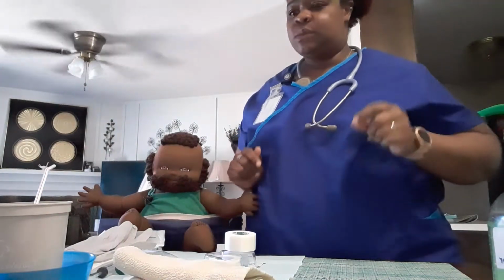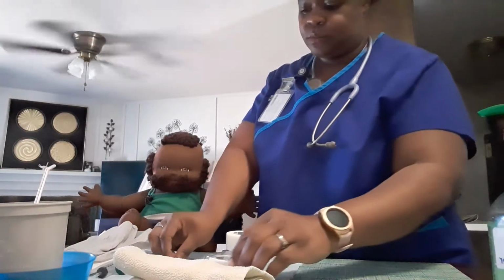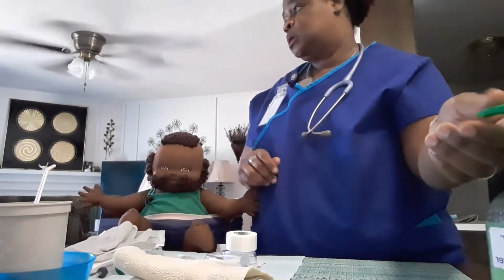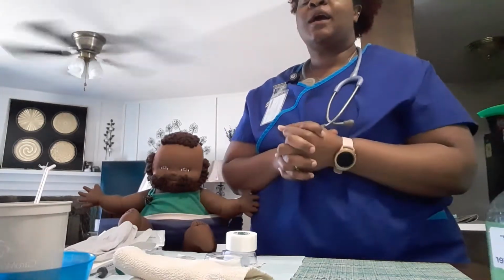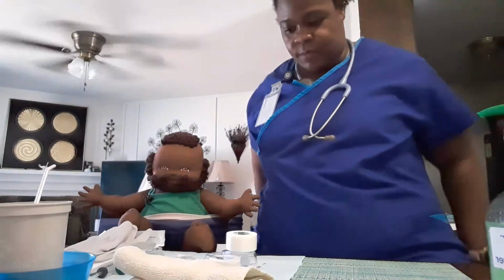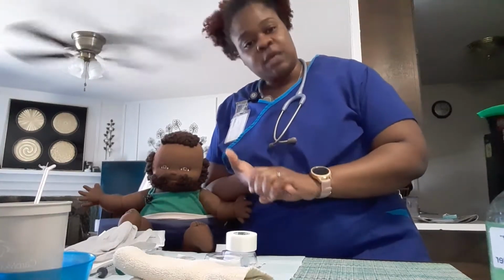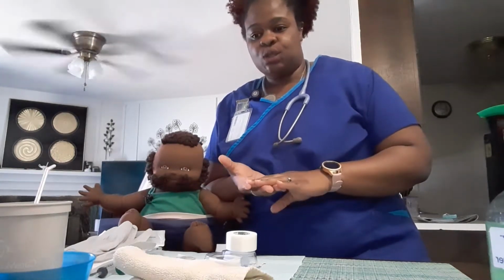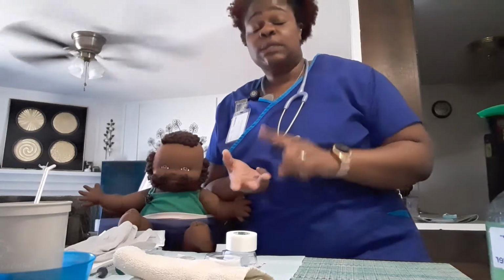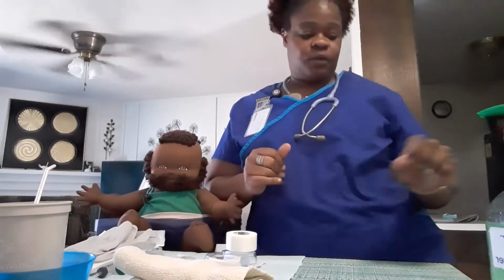The first thing I'm going to do is assess the patient's history. I'm going to check for history of aspiration, nasal polyps, nasal bleeding, anticoagulant therapy, chronic sinus infections, and surgery to the oral, facial, or sinus areas. Next, I'm going to take my clean supplies that I have on a tray, and go to the patient's room.